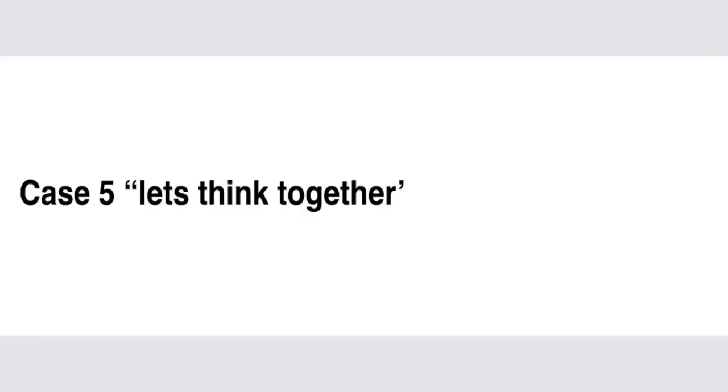So if you can guide it, although there is an initial cost which is questionable, if this cost is really very high, compare it to the safety of the surgery you're doing, and to the speed of the surgery, because you drill very fast, you drill in the right spot, and then you place the implant based on a well-designed treatment plan. That's what I share with people. I would like everybody to do the same type of dentistry based on guides.